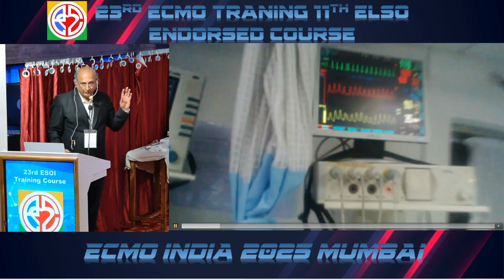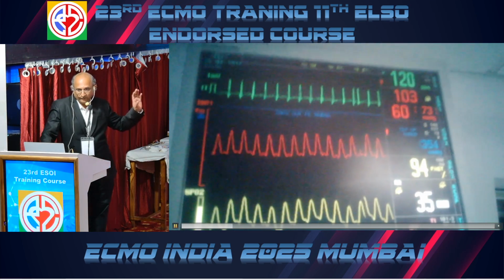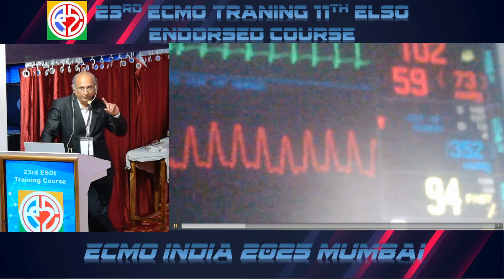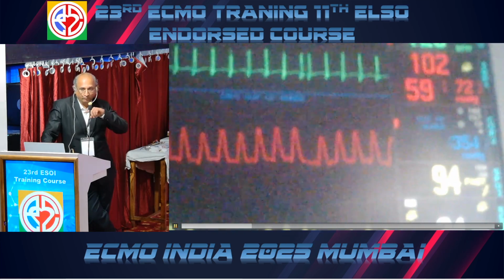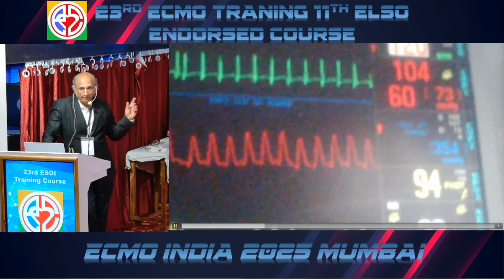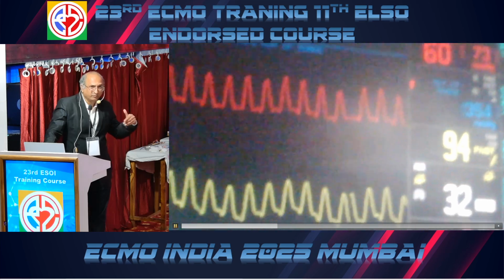These are the parameters you can see. When he was, you can see the pressure is more than 350. This is the pre-oxygenator pressure, which is 352, the one which is the blue line. You can see the RPM and flow. Saturation is still 94. He was doing well, so we were weaning this patient off ECMO.